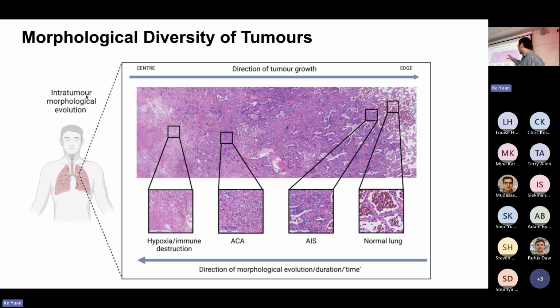So if you look at, in some cases, those changes in those phenotypes also correlate with the location of where those phenotypes are, making people think about why they came about, and maybe there's an evolution even within the slide between them, or it's actually the underlying 3D structure of the tumor that dictates that they look like this. So there's a load of information to learn and then try to understand from those images.